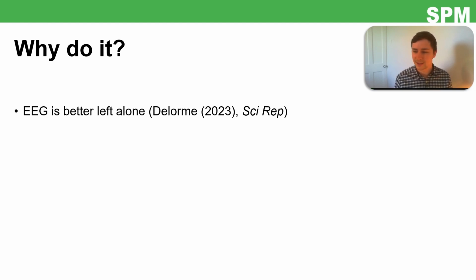This is essentially a paper which presents quite a clean data set with a nice simple experimental design, and shows that if you just apply, I think it's a high pass filter, and then just use averaging across lots of trials, you can get the same result that you'd get if you manually went through and also applied some sort of semi-automated methods to remove artifacts, to select bad channels, bad segments, all that kind of stuff, and showed that it doesn't help.